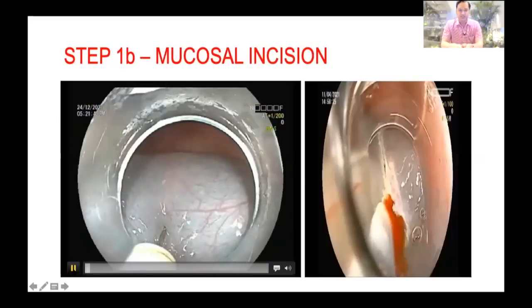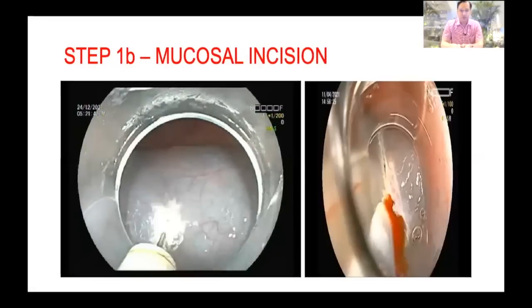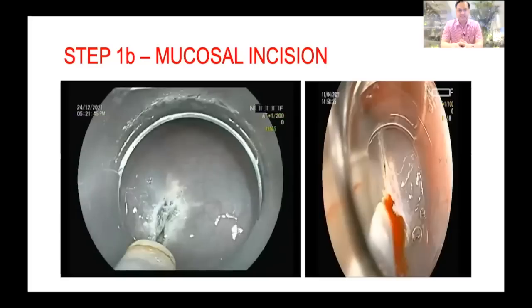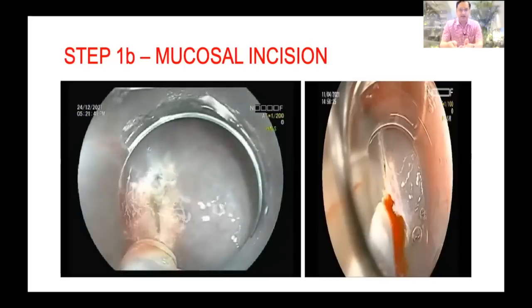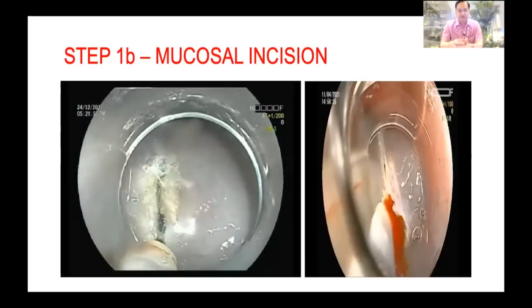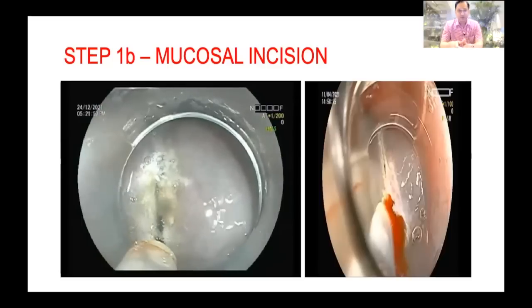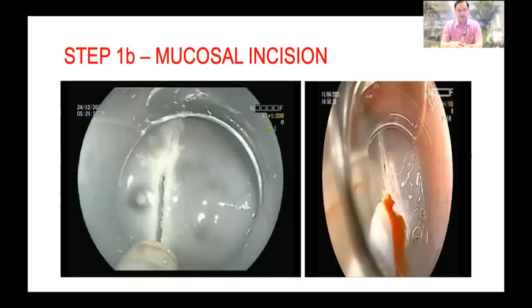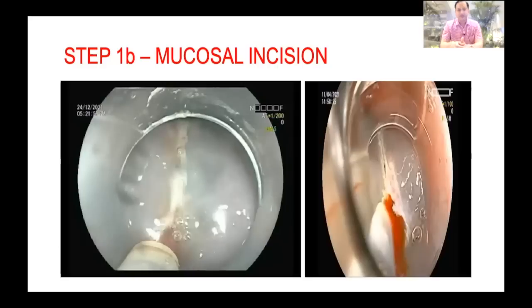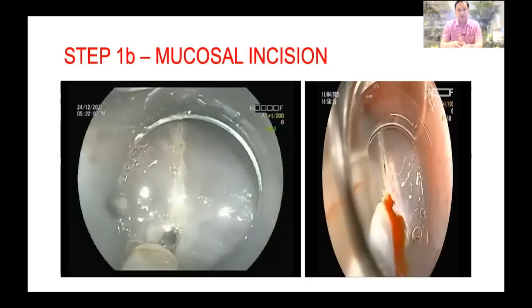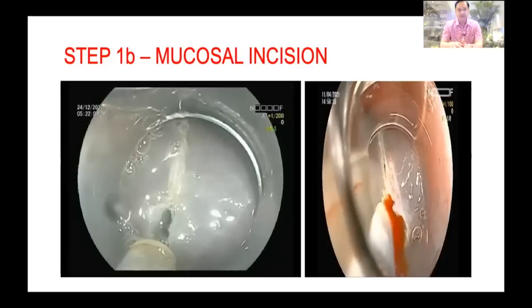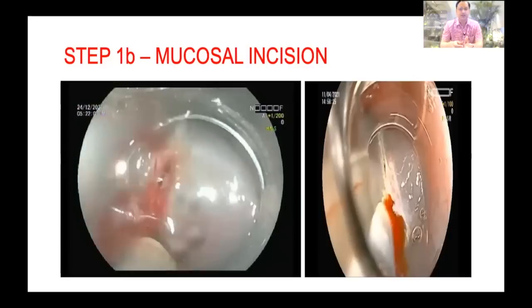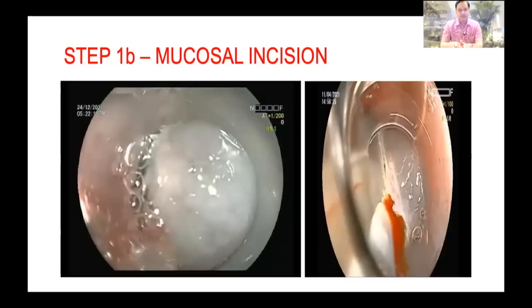Then you have to make a mucosal incision. First make a hole in the mucosa, then extend this incision antegradely and retrogradely. Here I am extending this incision on the retrograde side by withdrawal of the scope. Sometimes while extending, you can encounter some ooze from the mucosal margin which can be easily controlled by applying a few strokes of coagulation current, which you can notice here.